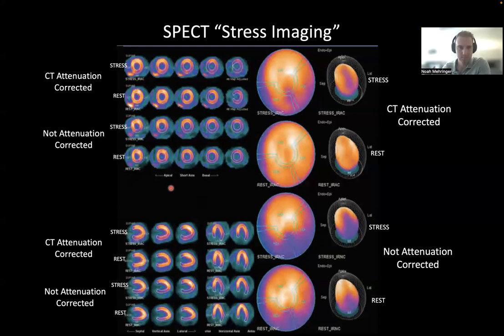Now, in this technique, you've got a pretty simple problem, because I have a monoenergetic beam. If I detect it, say my detector's in this configuration and it's coming out this way, then I can just integrate to that point and ask what is the relative attenuation of a 140 keV beam through this pathway, and model it with that intensity.